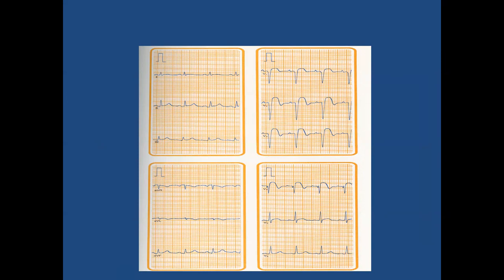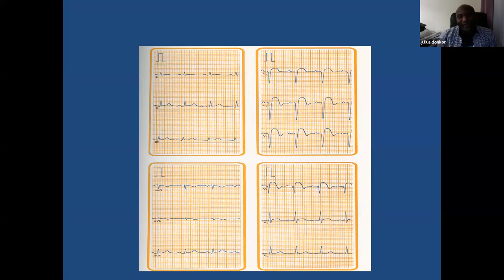Anterior MI. Yeah, anterior MI. But always tell the rhythm first. So if somebody asks you what is this rhythm, what would you say, Elvis? Because they will ask you that in IBHRE. If you don't say it, then if you just say anterior MI, that's wrong.